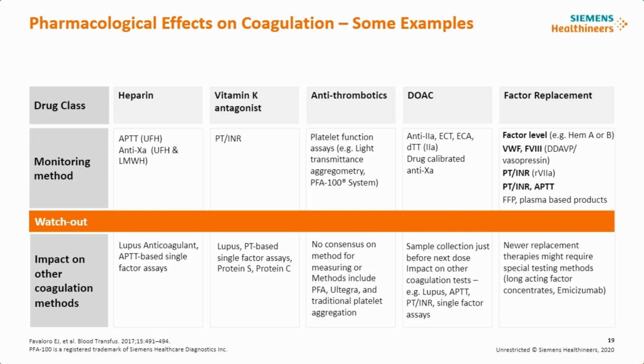They could be monitored by specific calibrators against that particular drug. Or you can have the anti-10A medications like your rivaroxaban or apixaban. And this is important. Knowing this information could perhaps allow you to choose which is the more appropriate test. And I'll just give a quick example.